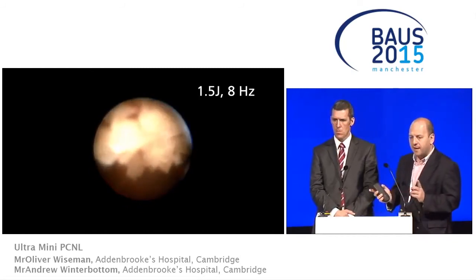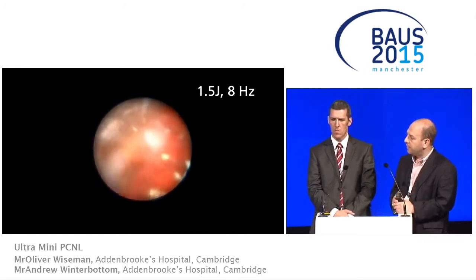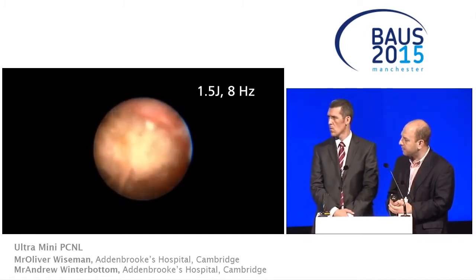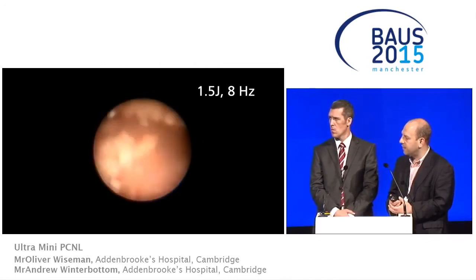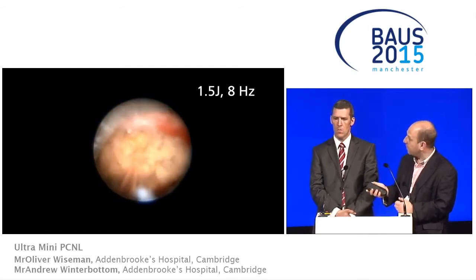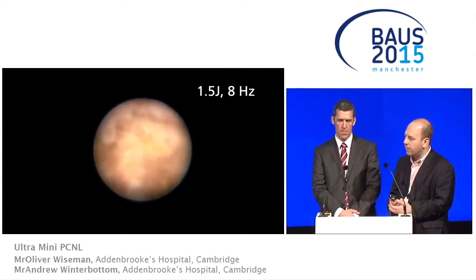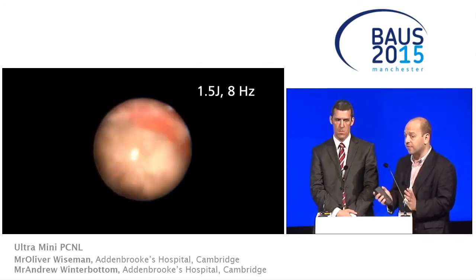If we just talk a little bit about sizes, because that was something which was asked before. Stuart, for your PCNL was 26 French, was that right? No, we used a 30 French. You used a 30 French sheath. And Sharon, you were 17 or 16? 16.5. 16, okay. So this sheath here is a 13 French outer diameter, just a little bit smaller than Sharon's. And then the micro PCNL, I think, is 4.5 French. If anybody knows different, then please tell me, but that's with the all-seeing needle, 4.5 French, also using a laser to fragment the stone.